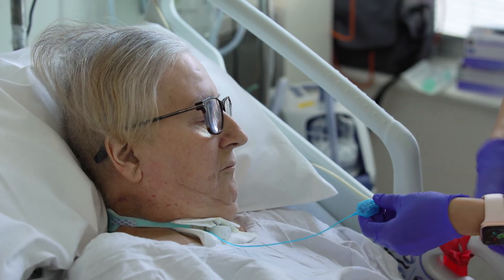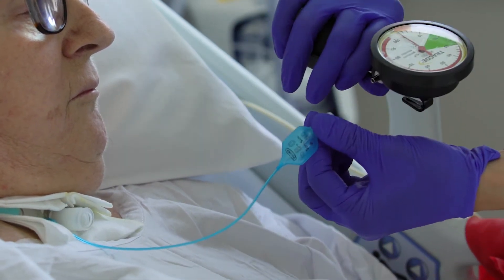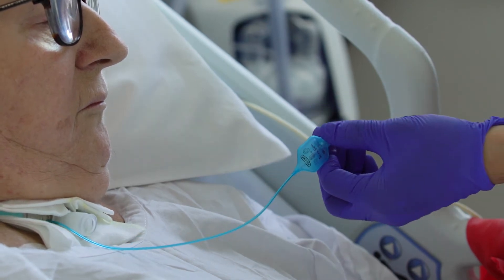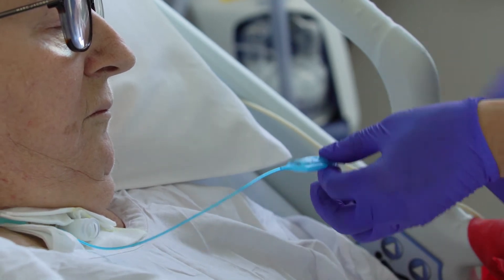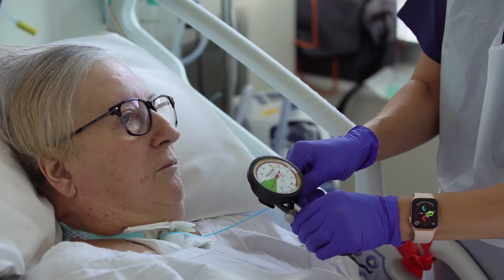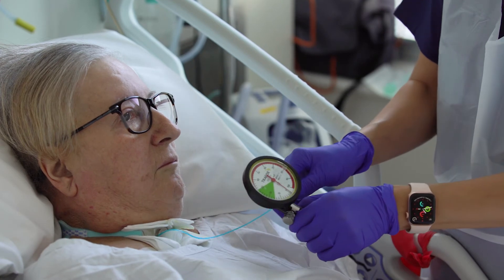Check that the cuff pressure is at the correct level using a cuff pressure manometer. Measurement of cuff pressure should occur at least once a shift, after cuff inflation, or if there is a suspected air leak. Connect the manometer firmly to the pilot balloon port and ensure that the pressure is between 20 to 30cm of water pressure.